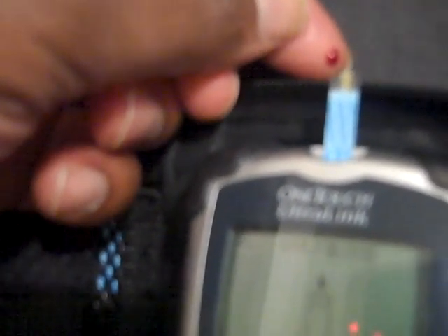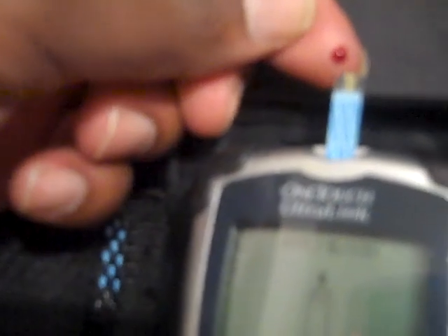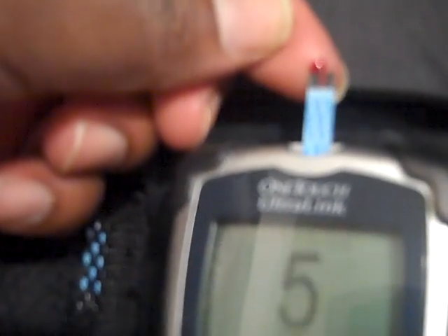I'm going to check my blood sugar and see what it is. We'll see what it is live on YouTube. 111 — that's actually pretty good. 111.